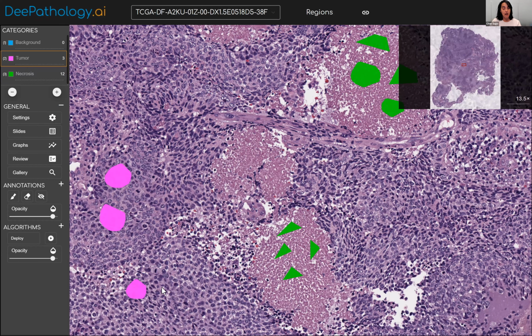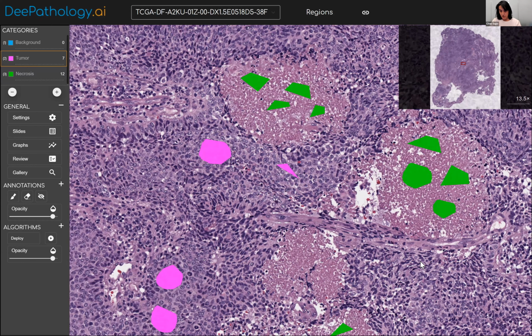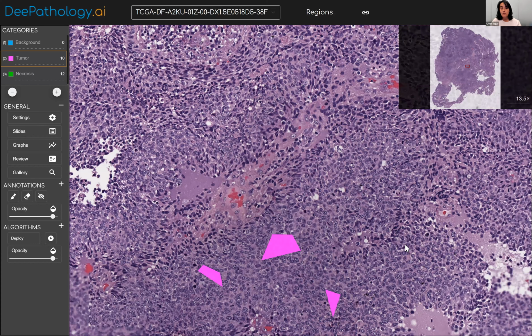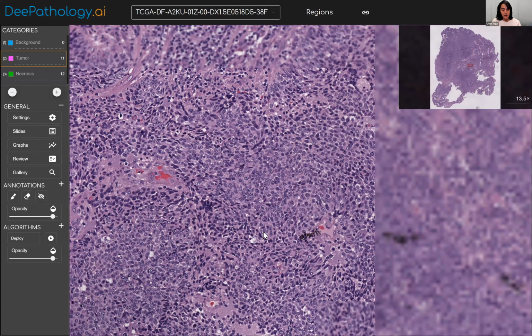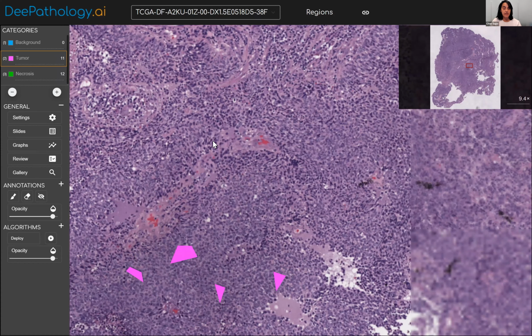That's very relaxing, to be honest. All this training, all this annotation. Let's go maybe here and annotate a bit more. You see that it takes a bit of time, and the real reason for that is that it's actually in the cloud, so it takes time depending on my internet connection.